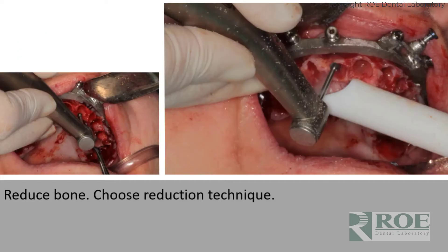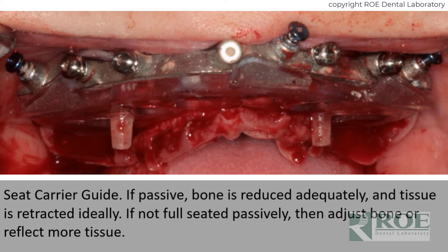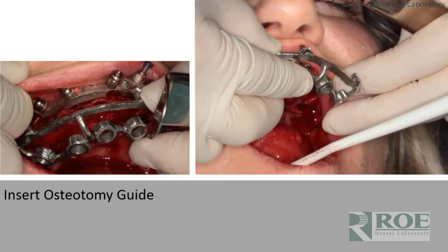Teeth are extracted. Bone is reduced down to the level and leveled. The carrier guide can now be tried in to make sure that it's passive. If it's passive, you know that enough bone has been reduced. If not, reduce more bone and seat again until it's passive. At this point, you can try in the prosthetic just to test the bite, and then they are both removed.